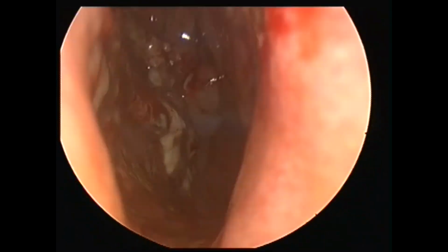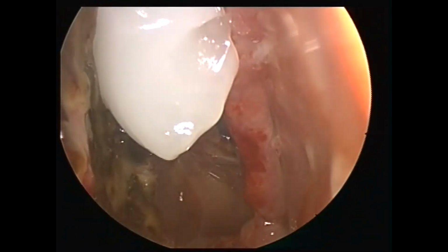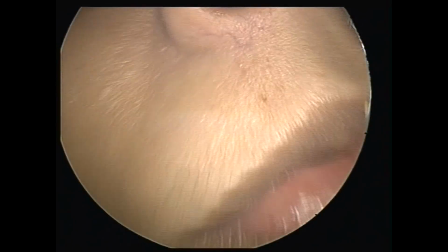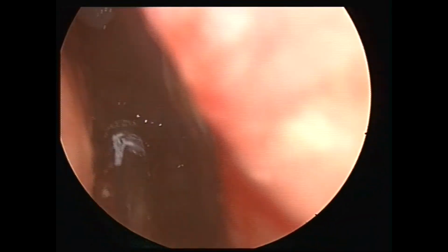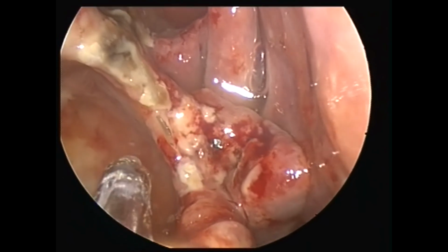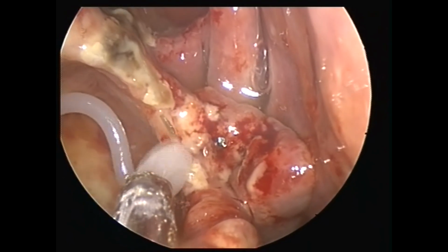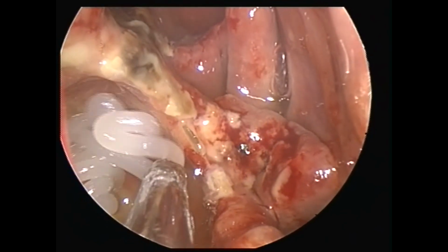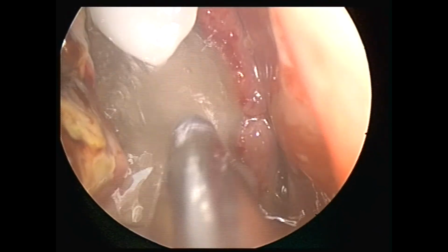Constantly ask the patient to go for nasal washes with steroid solution inside with Ringer's lactate, and call the patient for follow-up every 10 days and clean the nasal and the sinus area under endoscopic vision. So this is how you should follow up a patient. So I'm going to put the ointment now in the maxillary sinus. So steroid is the main course of treatment in case of AFRS, along with post-op nasal washes throughout for 3 months at least.